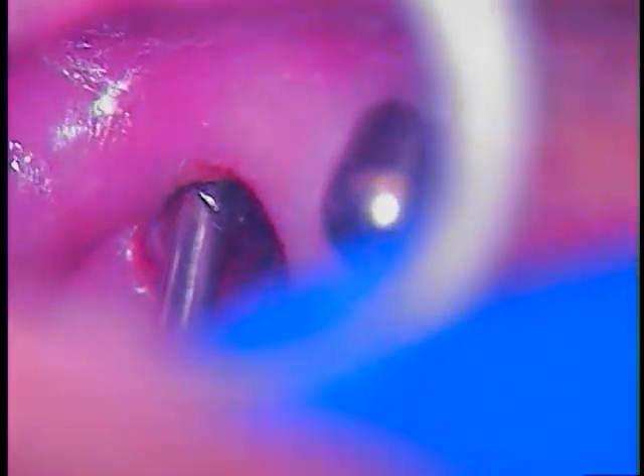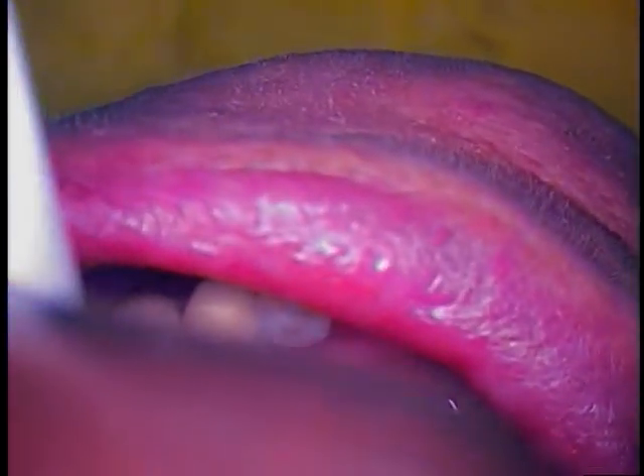You can get these little drivers anywhere, they're not that expensive — you can even make your own. Now this is about ready to come out, so my dental assistant is going to have to change suction position. Sometimes you have to put a little net or a two-by-two in there so it catches. This is going to sit on your tongue a little bit — it's a little piece of gauze, just sits on your tongue.